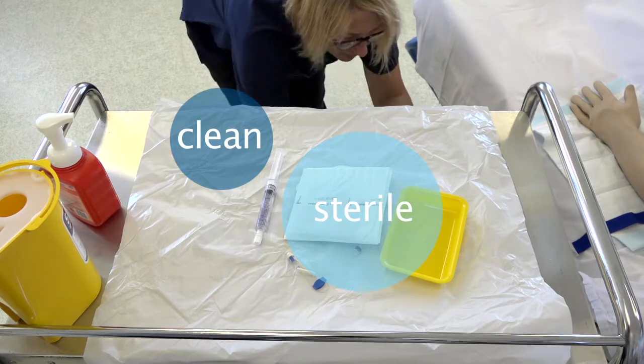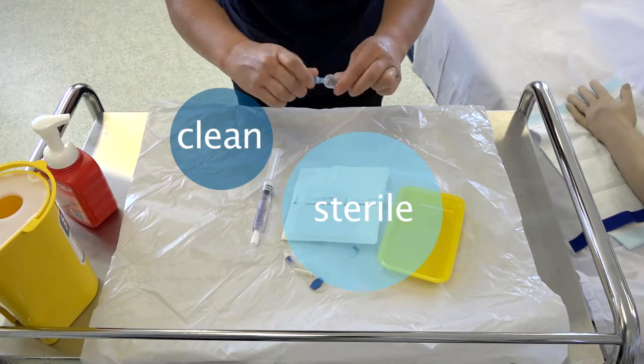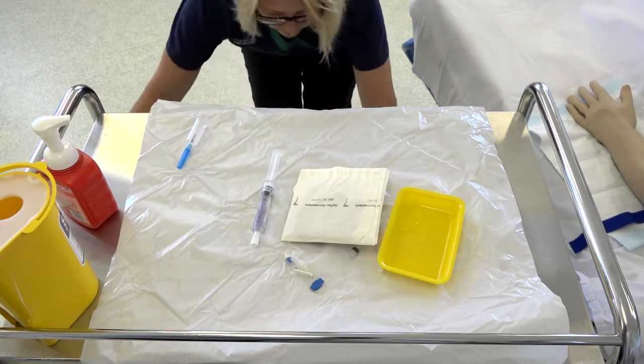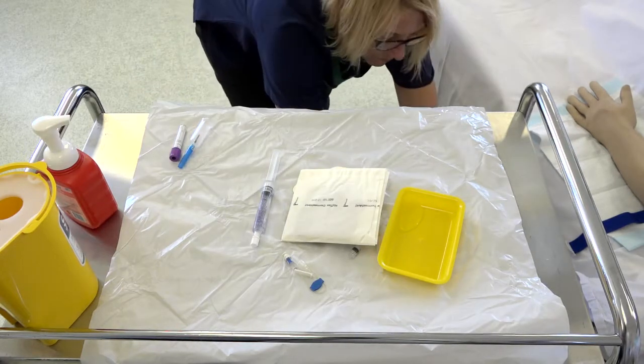Now prepare your clean zone, which includes your vacutainer and any blood tubes as required.